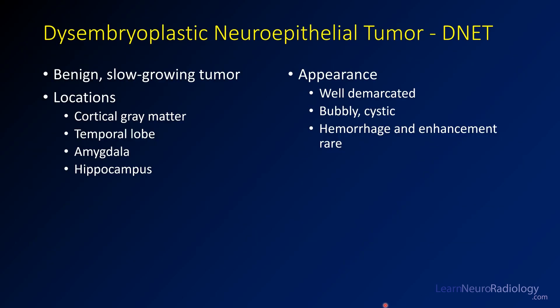What you're dealing with in this case is a DNET, or disembryoplastic neuroepithelial tumor. These are benign, slow-growing tumors that most often occur in the cortical gray matter. The temporal lobe — particularly the anterior temporal lobe, amygdala, and hippocampus — is a very common location. The classic description is a bubbly cystic lesion. So if you see a bubbly cystic lesion of the temporal lobe, think about a DNET. Hemorrhage and enhancement are rare; you can have a little bit of enhancement, as in this case, but rarely more than that.